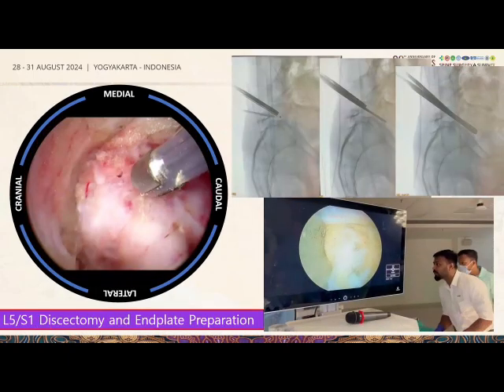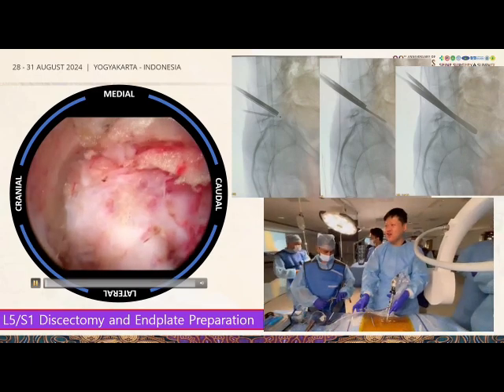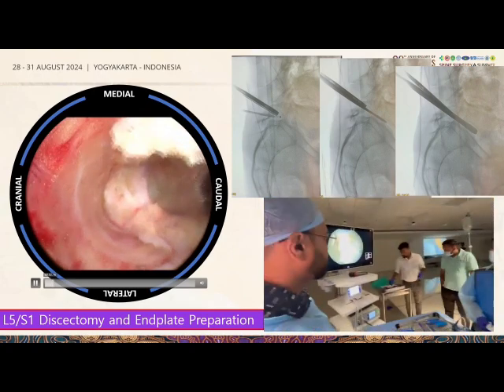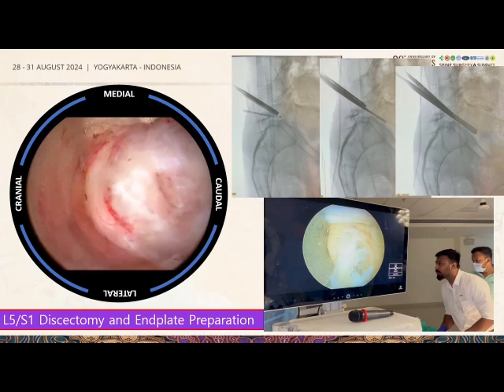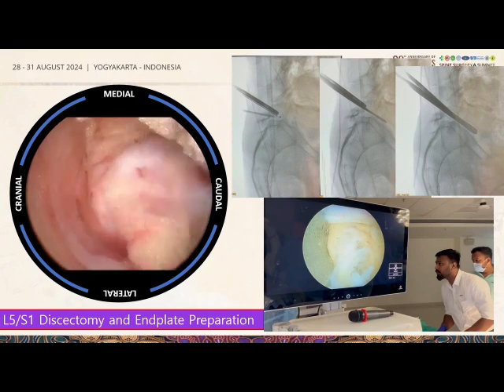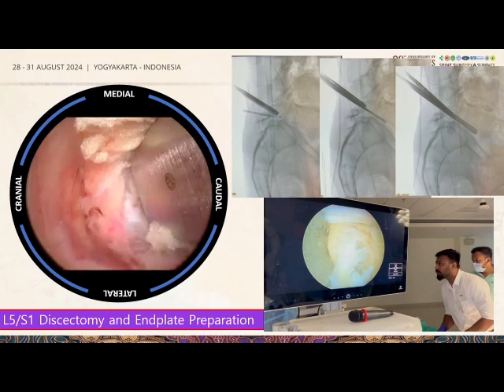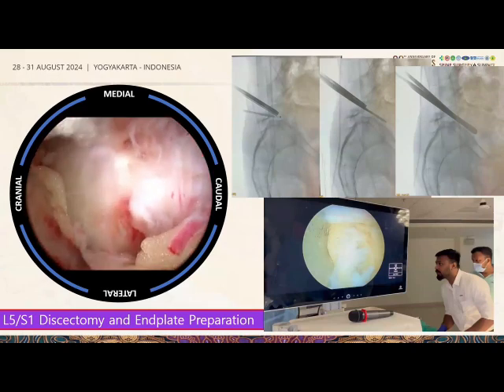After removing the ligamentum flavum, we expose the disc space. We use an electrocautery to confirm position with a lateral C-arm view to ensure we are at the correct level. Finding the correct disc level is important. You can also use the chisel gently, but do not go too deep so as to create an insufficient space for cage insertion.